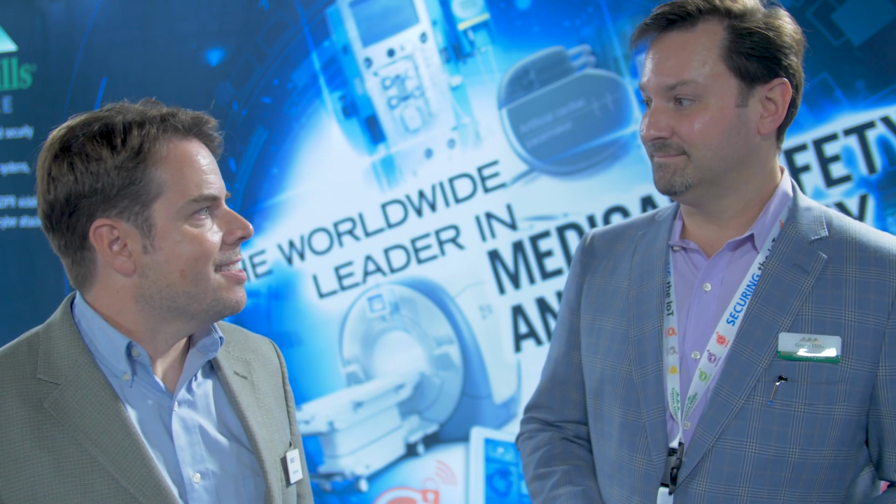You really want to have on-device encryption implemented to protect PHI and PII information, so that's one aspect of it. But also, you want to have encryption in the communication links to these connected devices. It also prevents, again, prying eyes and cyber attacks from getting into the device from the outside in. That's great advice, Heath. Thanks a lot.